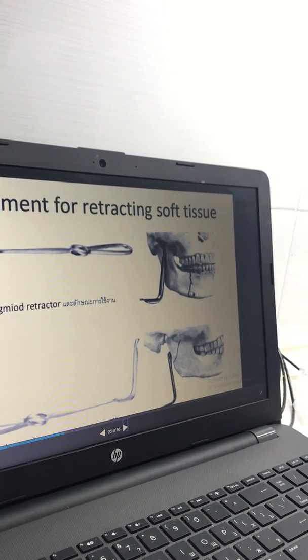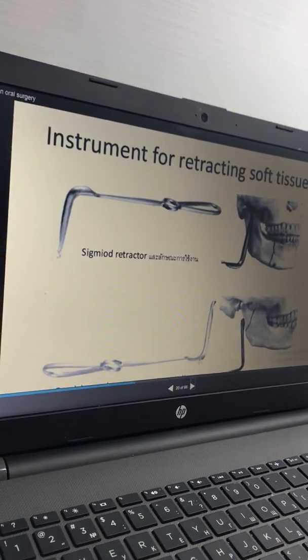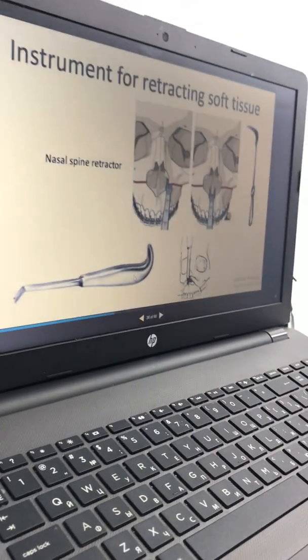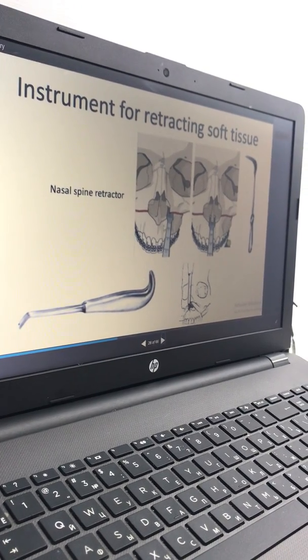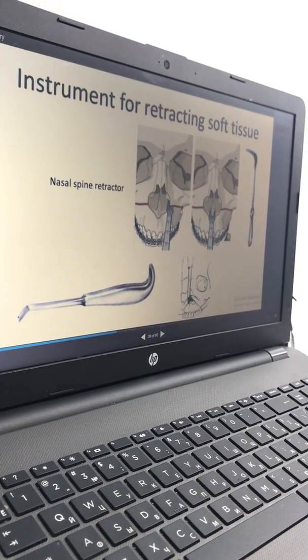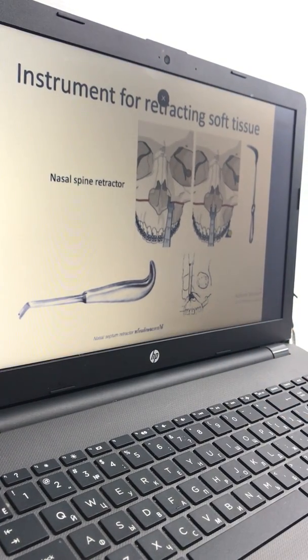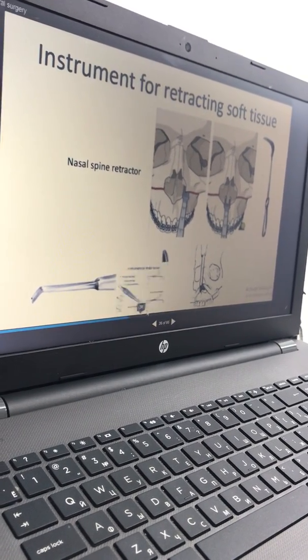This is a bony fracture, and see, all these instruments are used to approach the bone and approach the flaps. Each one has a special job. This is an instrument for retracting soft tissue. See, each one, this is orthognathic surgery. For the Le Fort 1 fracture they use a chisel and mallet. You will see. Each one has a special use, look, when he fractured, he used it to separate the bone from each other and bring it in front.